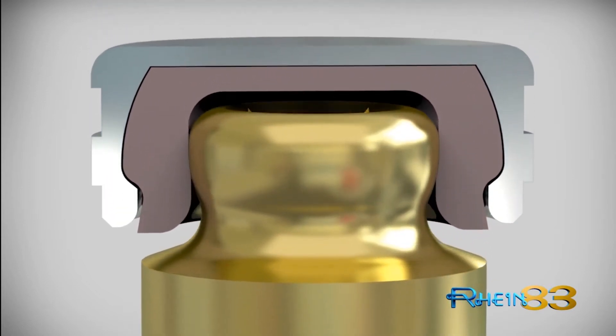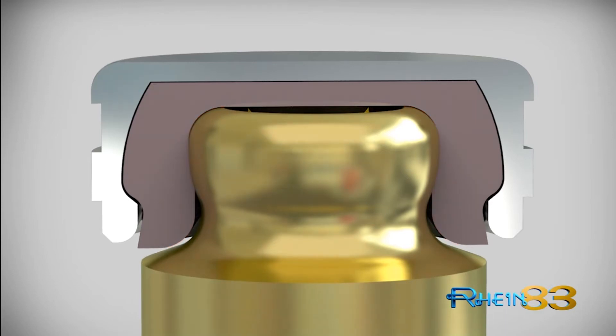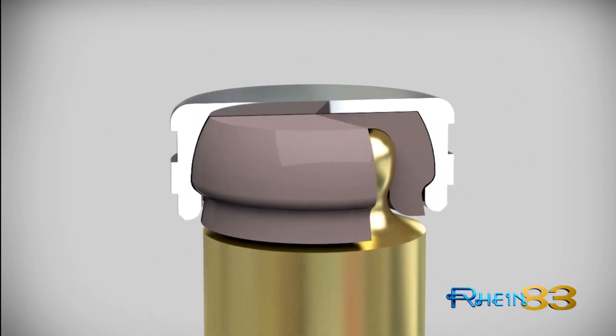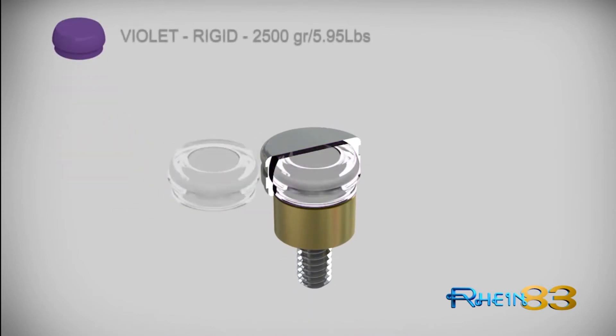The high degree of elastic quality designed into each RINE 83 retentive female cap allows for a greater contact zone interface between the cap lining and male component. Each cap assures superior stability and long-term functionality.